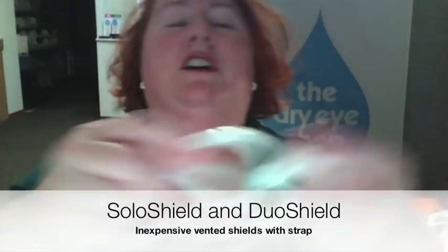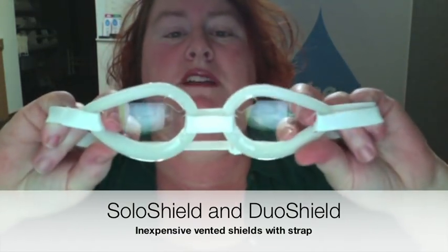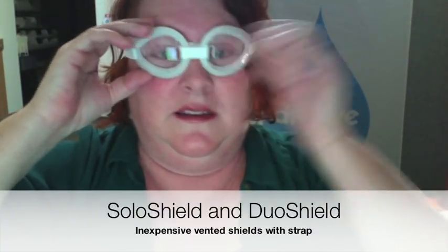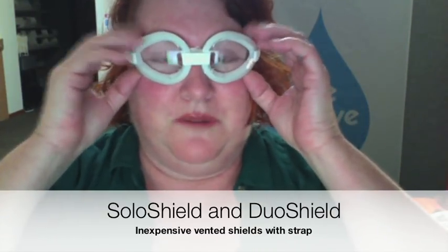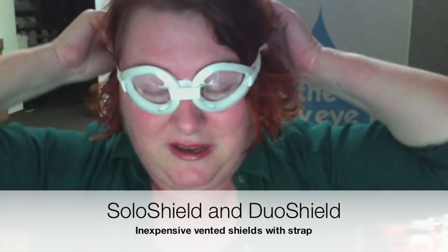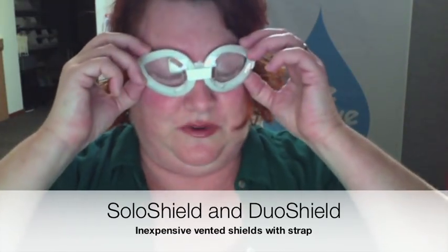Then there's the Duo Shield — that's two of those things cinched together, and again a strap around the back. Oddly enough I actually find this one a little more comfortable than the Solo Shield — it's just more balanced, there's less pressure on the pad. Again it's vented so it's limited, but it is some protection. It's rigid and the strap is skinny, but as long as you're not thrashing around a lot at night it should work reasonably well.